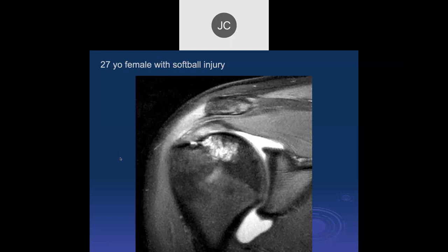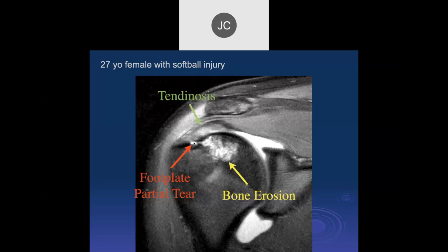27-year-old female with a softball injury. On PD fat-sat we see increased signal in the supraspinatus with traction cysts at the attachment. I'd be most worried about a little partial tear right at the bone interface, with a big bone erosion and tendinosis. So a lot of injury here, but this would still be considered a low-grade partial tear.